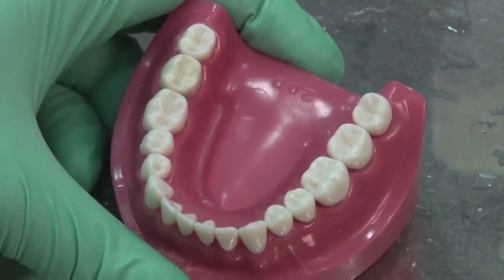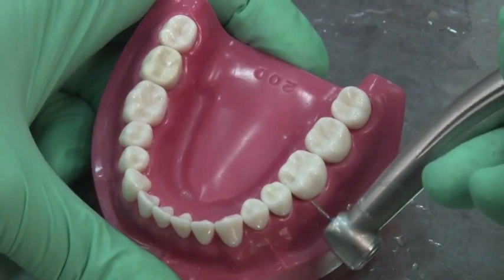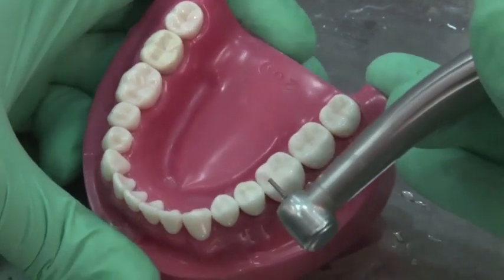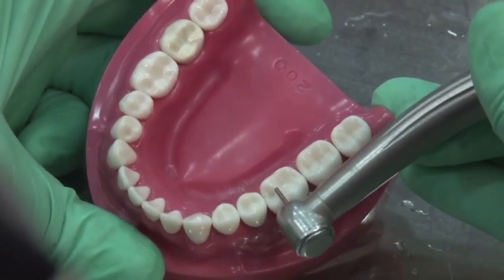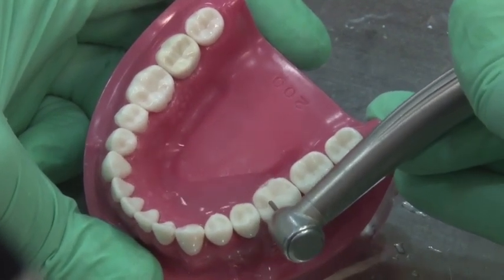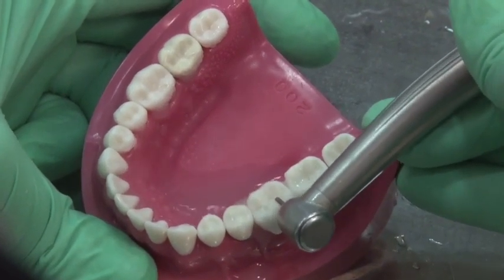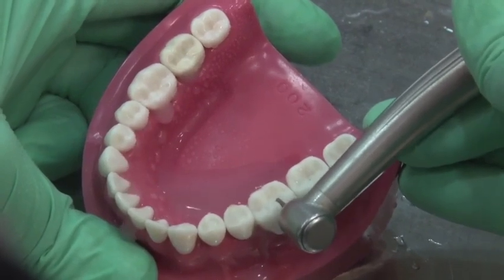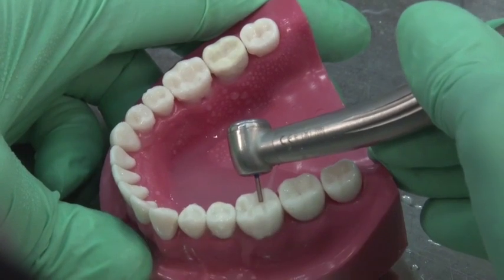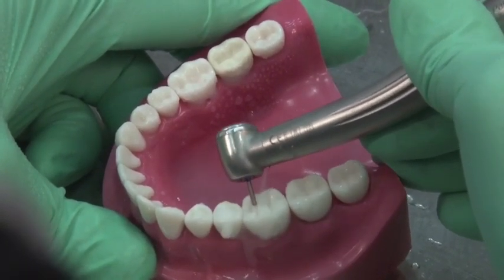To do an overlay or occlusal veneer preparation for a mandibular tooth, I first use the OR1.2 bur from the advanced bur kit for occlusal reduction. I sink the bur following the cuspal anatomy of the original tooth structure on the functional cusp to the full depth, automatically giving 1.2 mm of occlusal reduction. I do the same on the other functional cusp, then move to the lingual, sinking the bur slightly less than full depth — only about 1 mm reduction needed on the non-functional cusp.